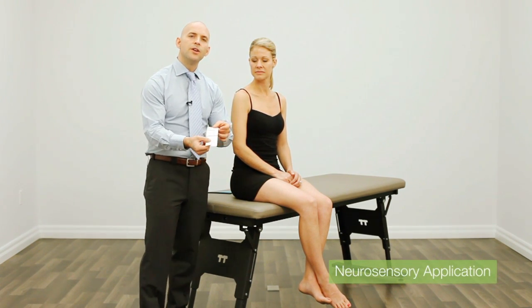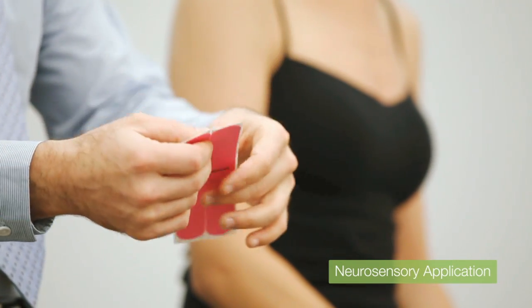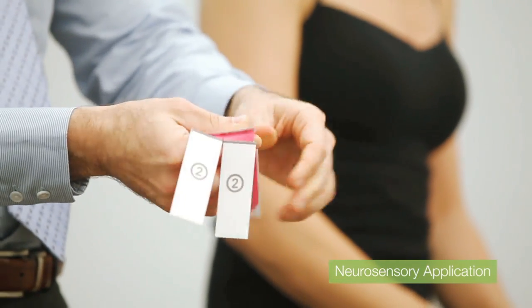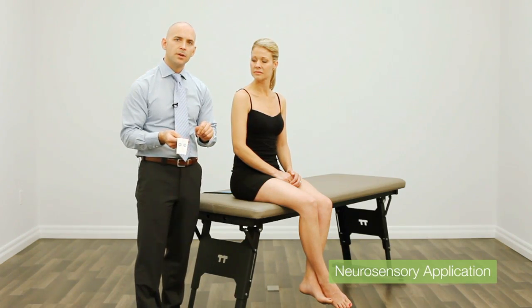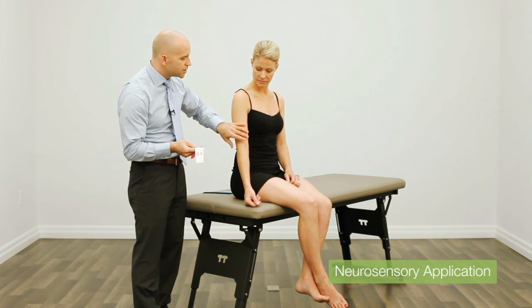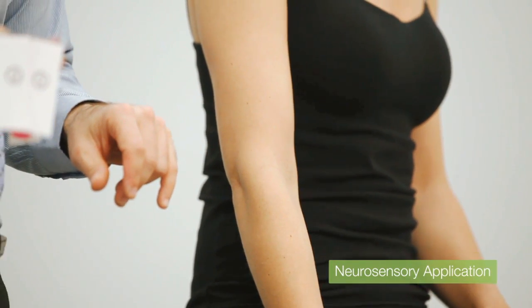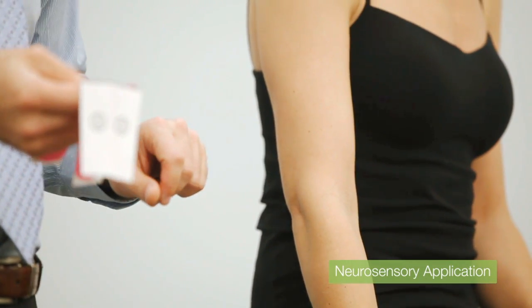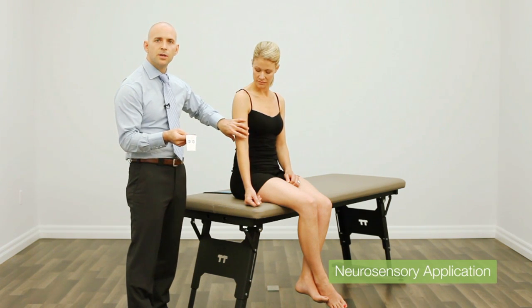Let's start with a neurosensory application using a pre-cut X. We start by tearing the perforations along the black lines. We determine where we want to apply the tape — for all three of these examples, we're going to use the anterior arm. When using a neurosensory application clinically, I'm thinking that I want to reduce the discomfort that my patient is feeling and I want to normalize muscle activation and muscle tone.